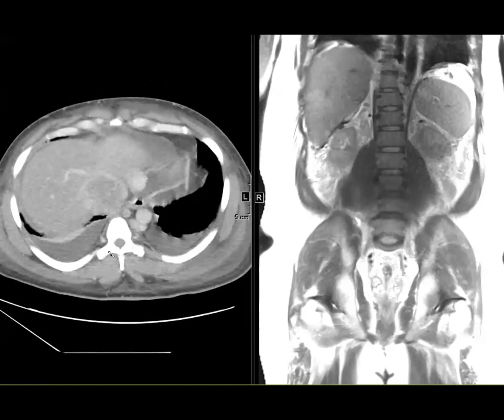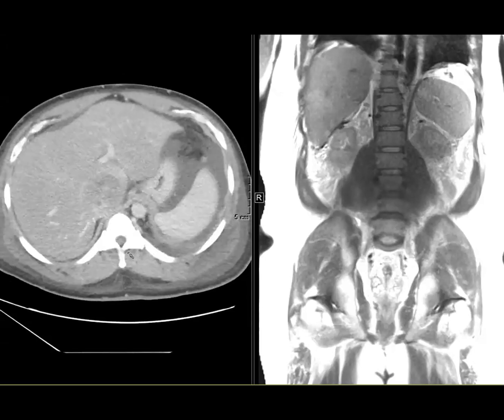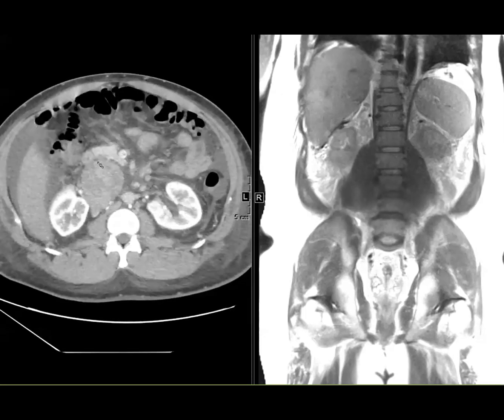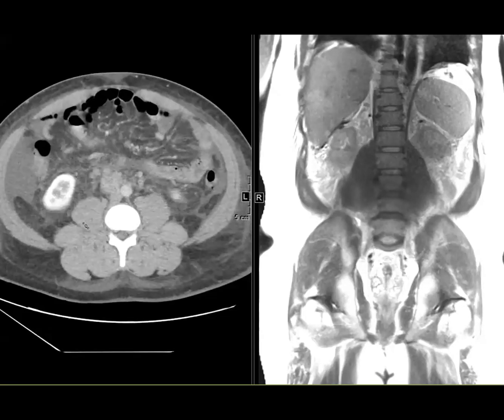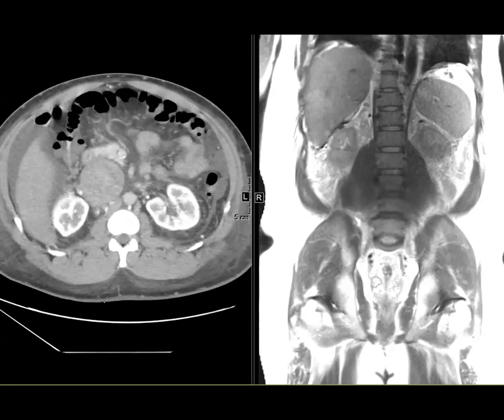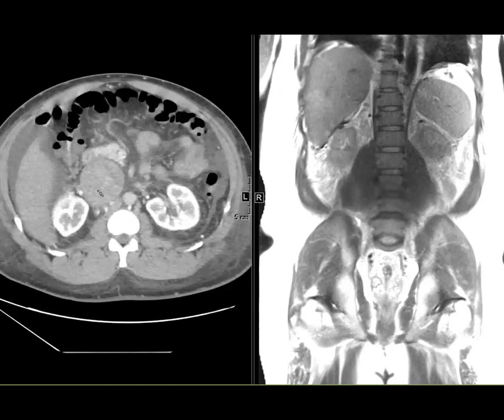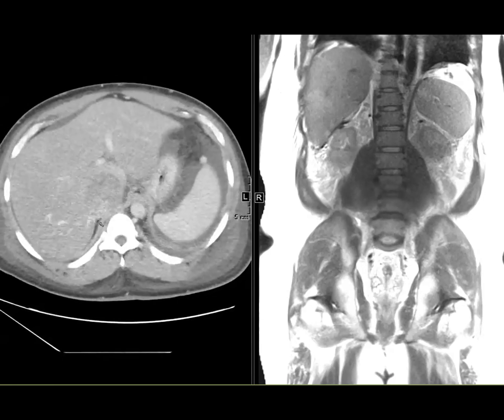This ended up getting biopsied transjugularly and came back fibrosis, so they ended up having to repeat the biopsy. In general, for leiomyosarcomas, you want to go from above because they can have bland thrombus from below. So if you go through a femoral vein approach and go to the bottom of the tumor, you could just biopsy the bland thrombus. But in this case, they ended up getting the diagnosis through an IVC biopsy from below. I don't exactly know what happened to the transjugular biopsy, but from above, it didn't work out.